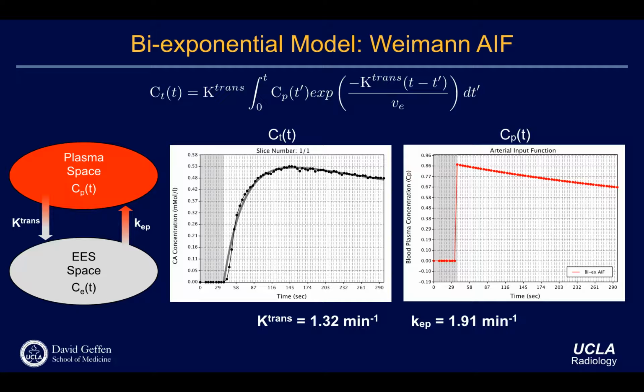Is the CP at a certain location of the blood vessels or the lower blood vessels? Overall. I mean, that's a great question. A lot of people are speculating about global AIF versus local AIF. But here we don't really care. We're just assuming everything to be the same. Sure, there are some papers talking about global versus local, and they actually behave differently, so there are differences. But here we're ignoring all the differences, just assuming CP is the same thing. Not only across location, but also across different people. Okay? So it's a very simplified model.